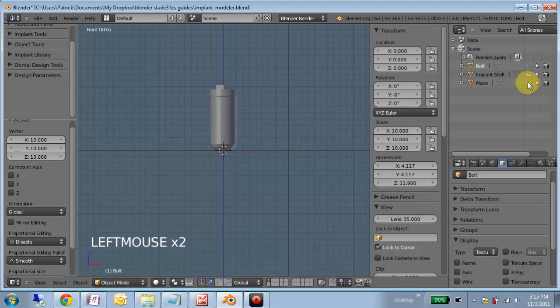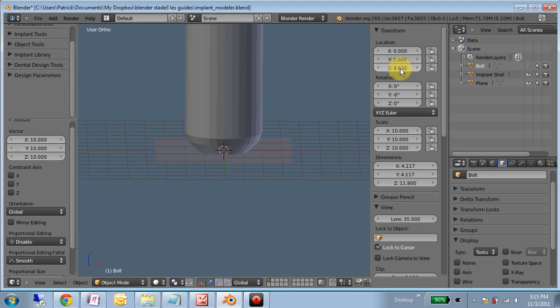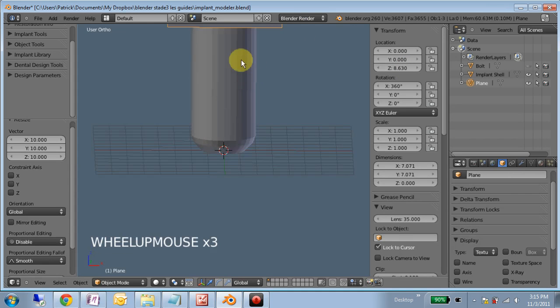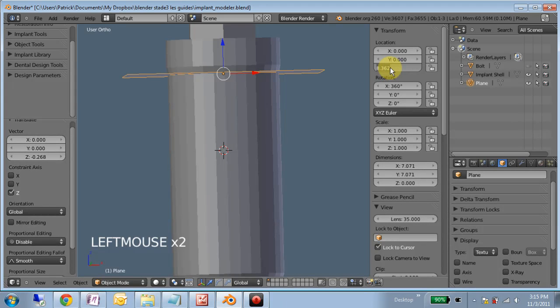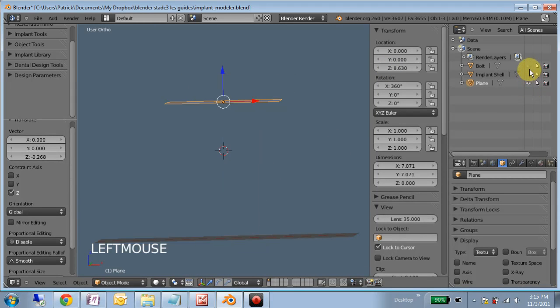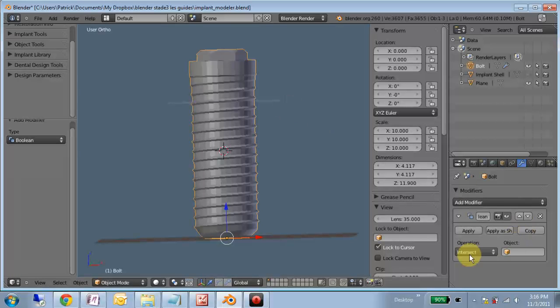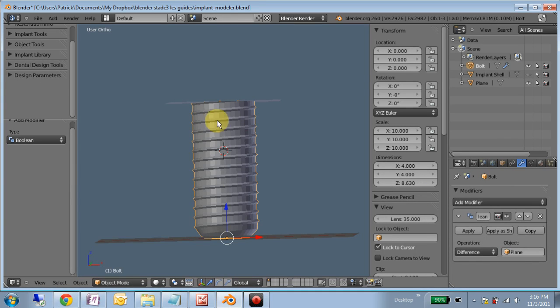We'll hide the bolt for the moment. Take a look at our plane, and I'm going to move it up to 8.63. Sorry. Okay, so that moves us right to the base of the collar. If we wanted to come down here for a bevel, we could move it a little further, but I'm content with this. Okay, so we'll hide the shell, unhide the bolt, select the bolt, add a modifier, Boolean difference, plane. Okay, so that kind of cuts off the top.